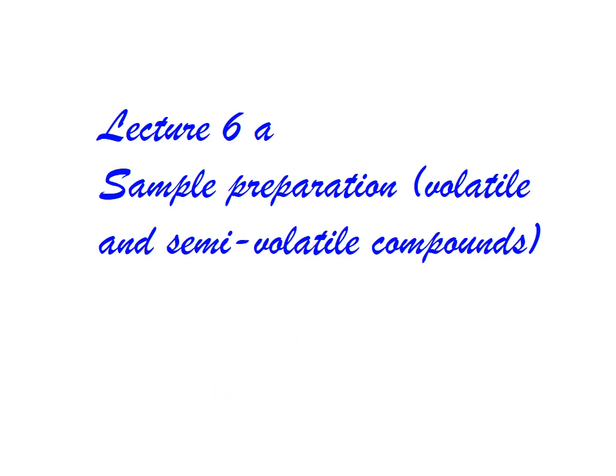Okay, so we have a sample, but you cannot analyze it directly. You need to do some sample preparation, maybe to concentrate, to separate your analyte, toxic compounds or drugs of abuse or something of interest from most of proteins, salts, all these messy matrices you have in a real world sample. So let's look what can we do with different type of compound.